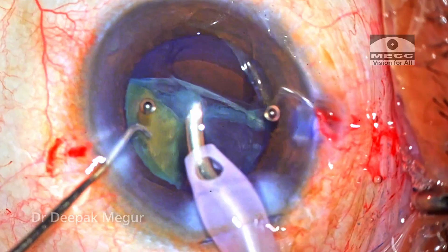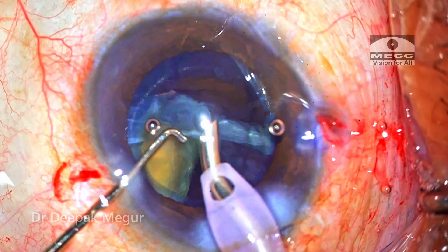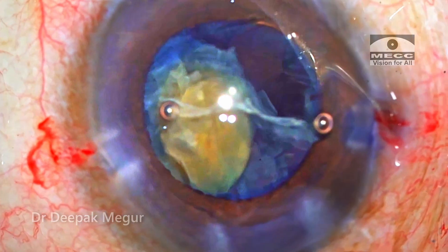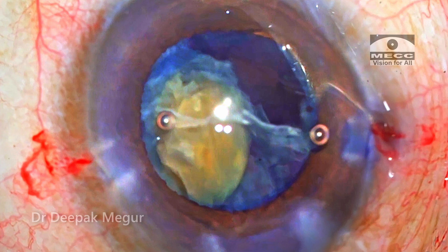As I tried to catch one of these fragments, this is the obvious sign. The epinuclear sheet, appearing as a membrane, is sticking probably to the posterior capsule and it is floating up now. I assume the epinucleus is sticking onto the posterior capsule and both these fragments are probably below the level of the posterior capsule. This is my initial suspicion.